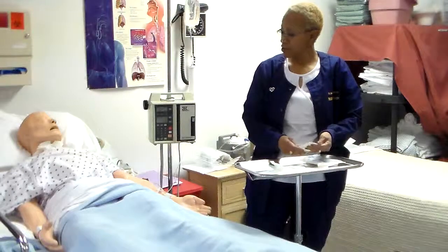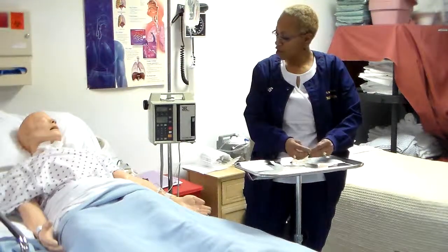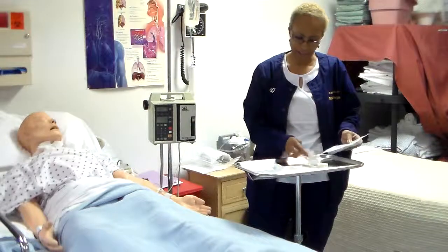Now, if you have any burning once I've started this medication, or if it feels cold at all, or you see any swelling or anything like that, then please let me know right away. Just put on your light. Okay, so my medication is fine.